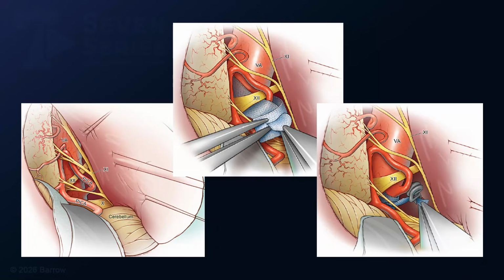These illustrations show the sling technique. You can see the pathology in the lower left. You can see the creation of that sling with the slit and the pointed end. And then you can see to the lower right how the dural pocket and the aneurysm clip create a pulley to anchor the tail of the lasso and transpose the vertebral artery forward. This construct creates a vector that pulls the artery away from the brainstem.